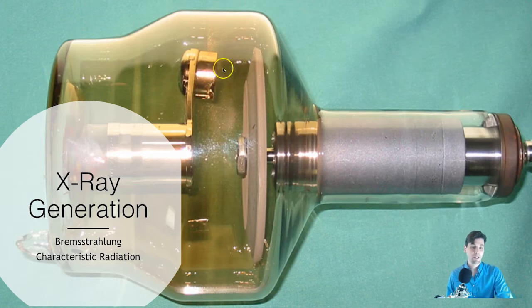They come out of what's called the cathode. They hit the anode. So there's a stream of electrons bombarding this heavy metal, and then the X-ray photons will be coming out in this direction. The two characteristic interactions that we're going to talk about are called bremsstrahlung and characteristic radiation, and we're going to go through those two and how an X-ray spectrum looks and why it looks that way.